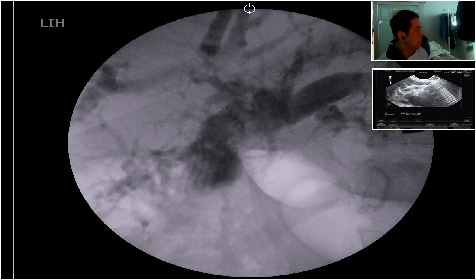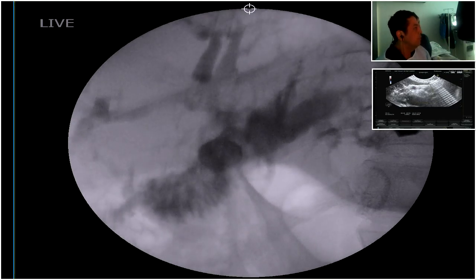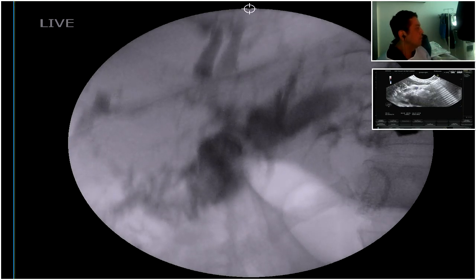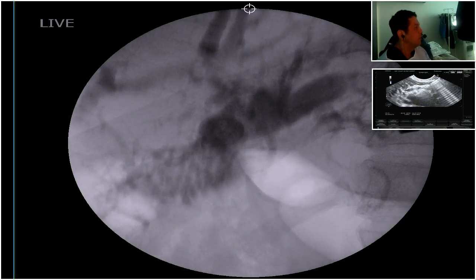And what we will perform is a fine needle biopsy of the liver just to see if this patient has liver cirrhosis now. So I will provide this cholangiography. You can see, look, the bowel is perfect. The passage of the contrast is going to the bowel, and there's a reflux. You can see it. Okay?